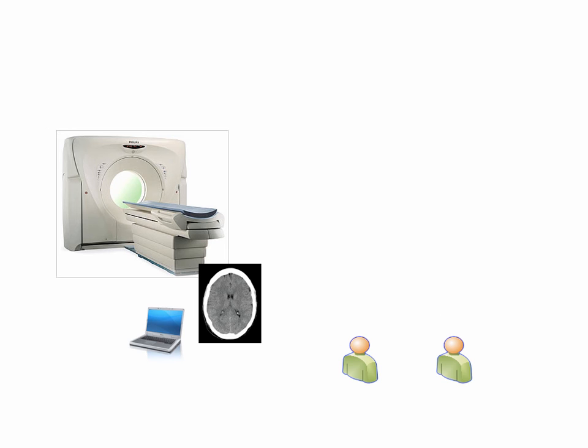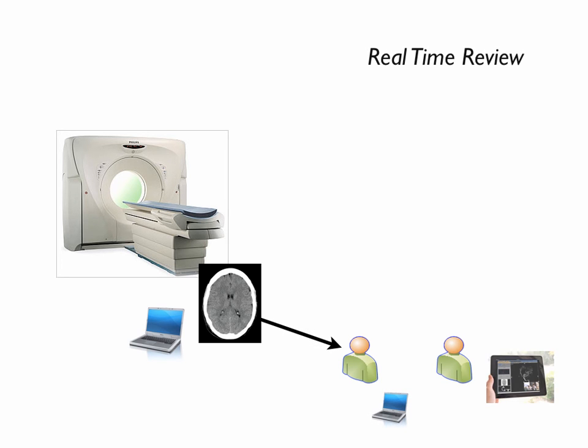However, if you thought about it and you said, well look, I'm going to take the image from the CT scanner direct and broadcast it out to the care team, you could have real-time review. Why does this matter? For things like collaboration in the cloud, where you want to be able to bring the stroke team in and all see the same images in near real time, this can be imperative. The patient is still in the scanner, you're calling the neurologist, the neurointerventionist, and the neurosurgeon. They're coming in through whatever device is handy, be it a desktop, a laptop, an iPad, an iPhone, simply because they have an internet browser available to them.